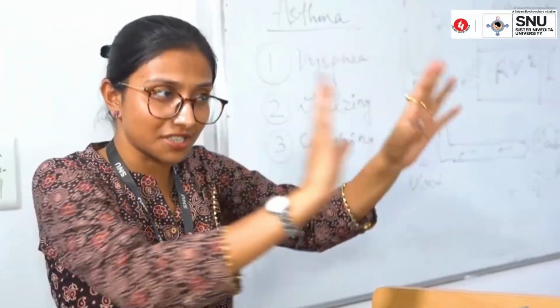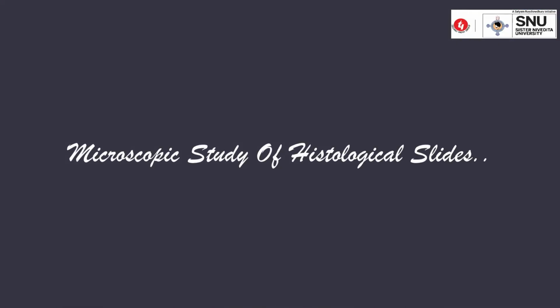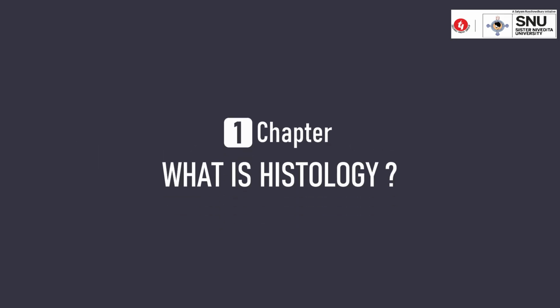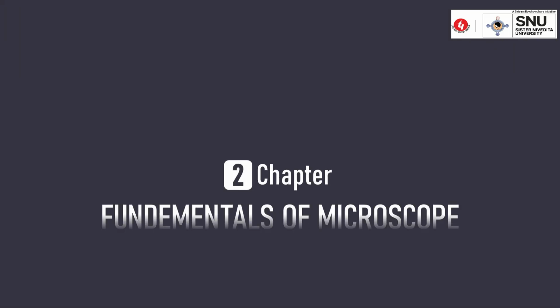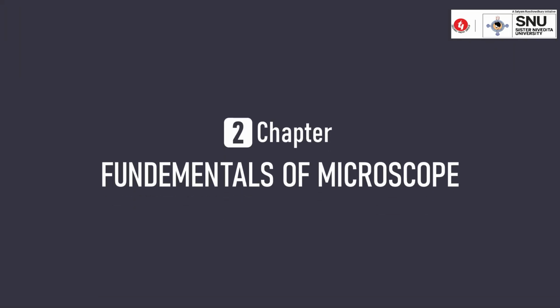Today, in this video, we will explore all of these structures through the microscopic study of histological slides. So, let's begin by understanding what histology actually is. It is the branch of biology and medicine focused on the microscopic study of the structure, organization, and composition of biological tissues. Now let's all unlock the gateway to the fascinating microscopic world of histology.